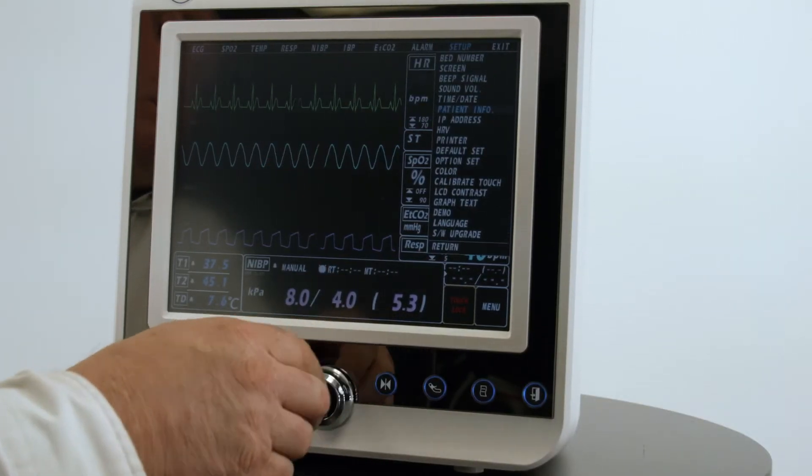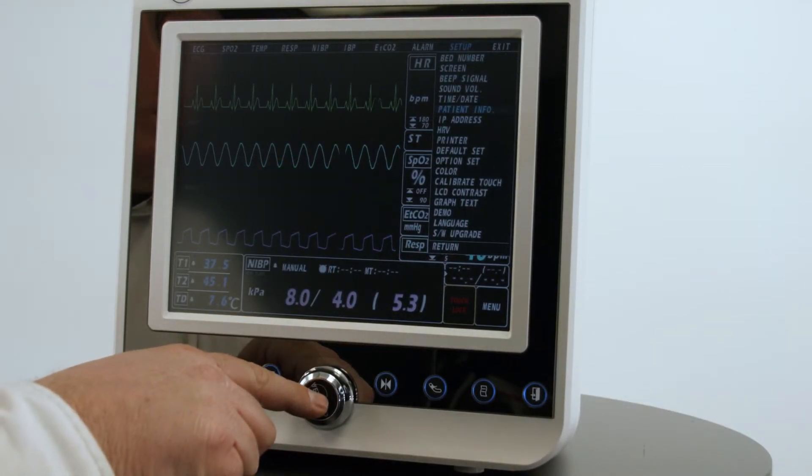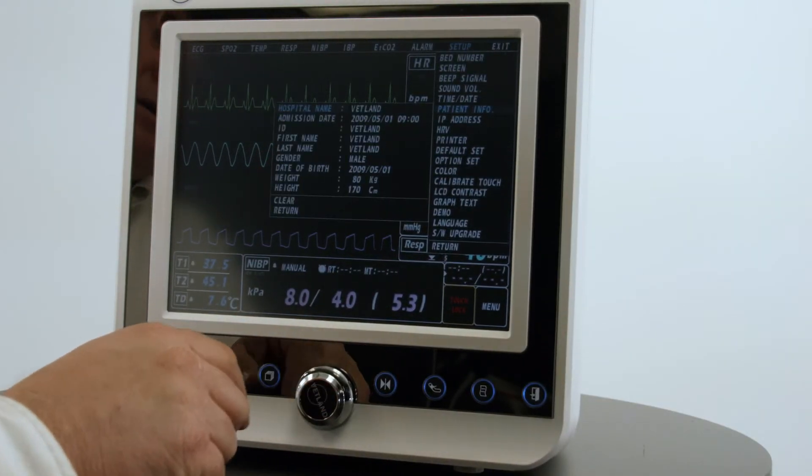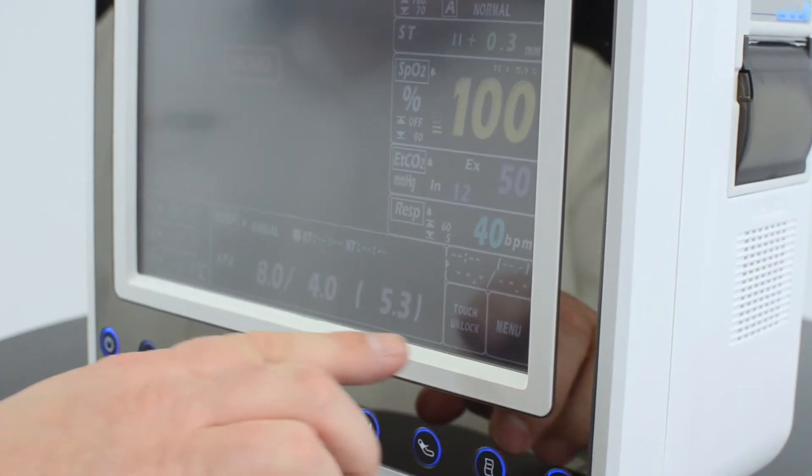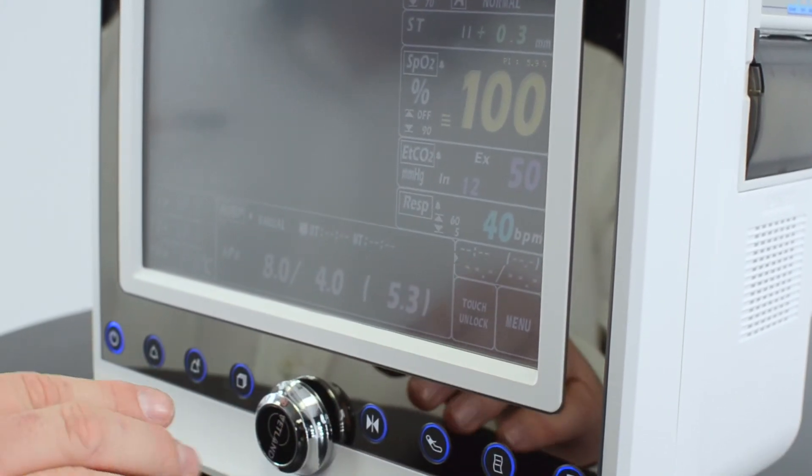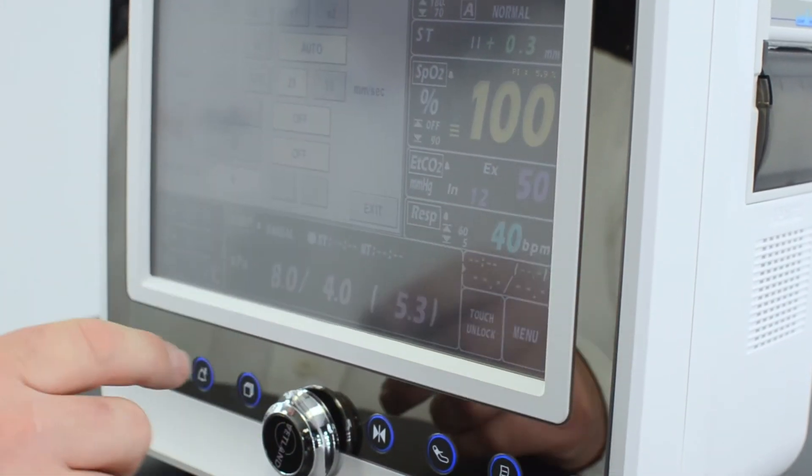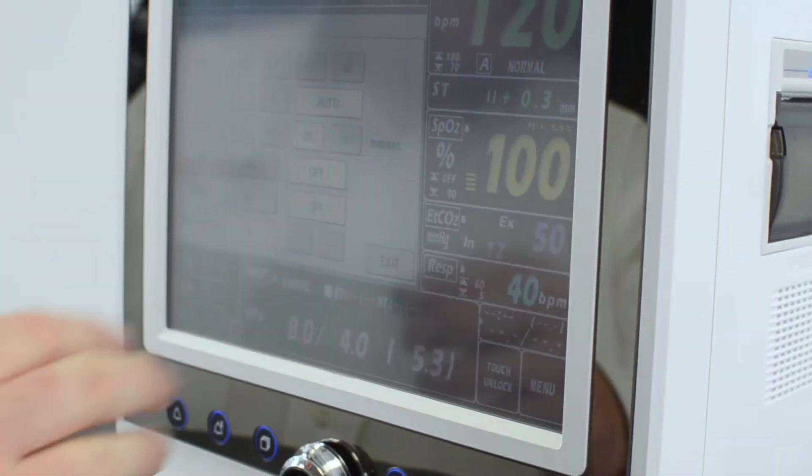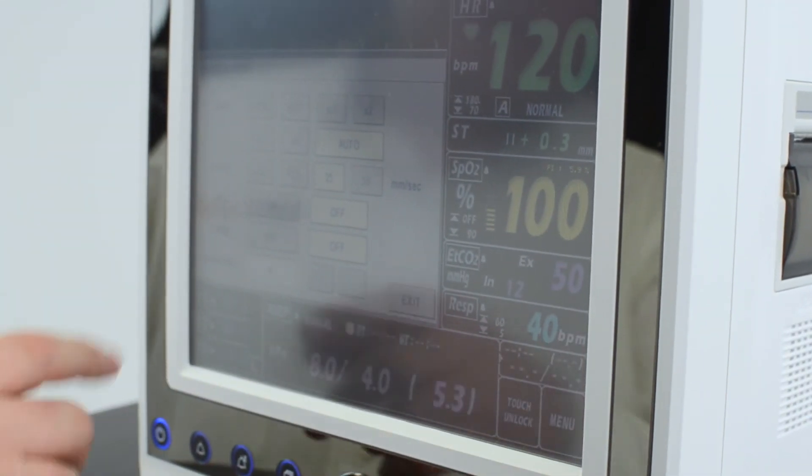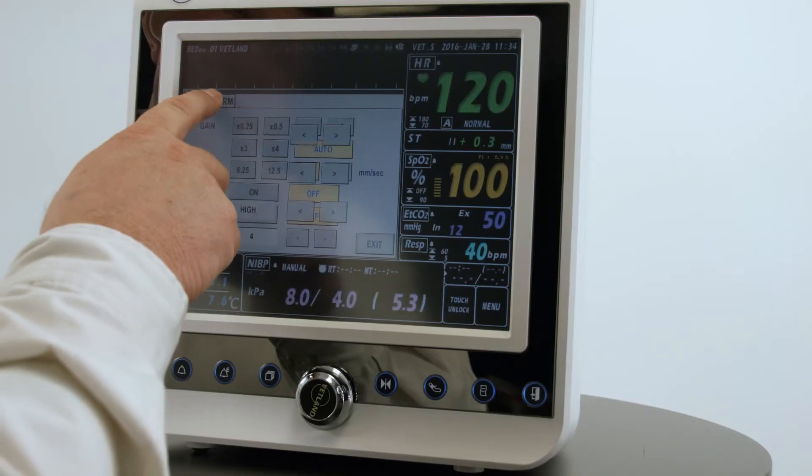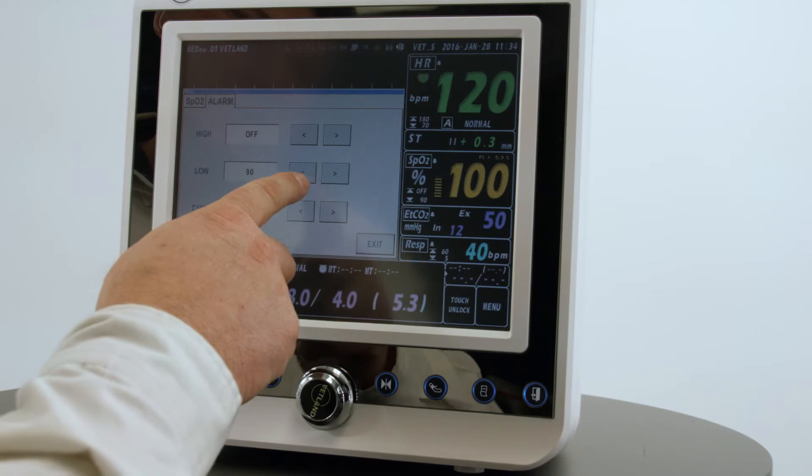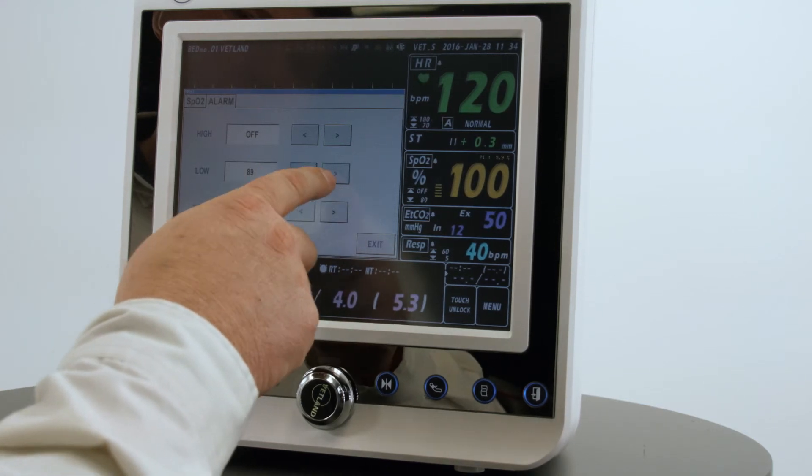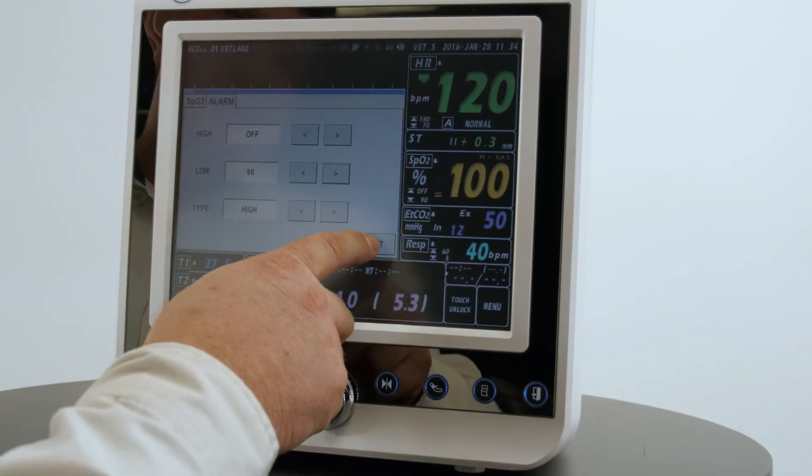You can press the trim knob and scroll to set any of your parameters. This monitor has the touch screen option implemented, so you would touch that area. We want to adjust the pulse oximeter, for instance. We can go into the alarms and we can reset the high or low alarm limit and exit.